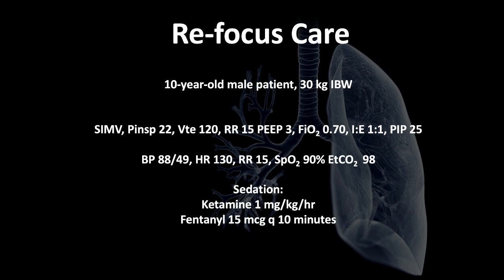And that's the thing you got to remember is in these asthmatic patients, you may have to go over that 35 centimeters of water or where we keep that threshold, right? You might have to generate a bigger breath. You need to understand your ventilator. You need to understand our high pressure limits and where we can go. Hamilton peaks out at 60. So understand where your thresholds are.